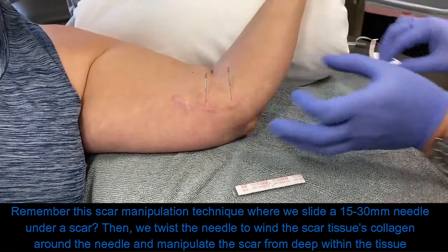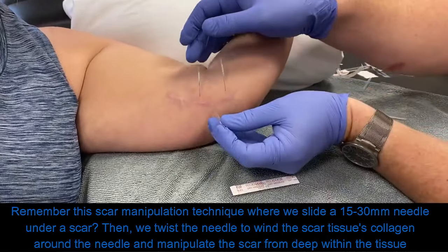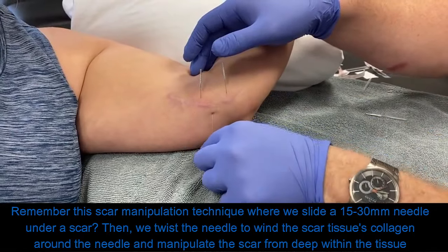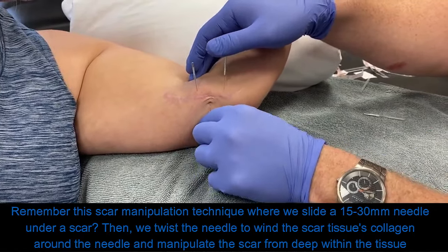So we insert our needle about a half a centimeter away from the scar, using a pretty superficial technique. We're going to take that 30 millimeter myotech needle and just kind of slide it directly behind the back side of the scar, varying positions along the scar.